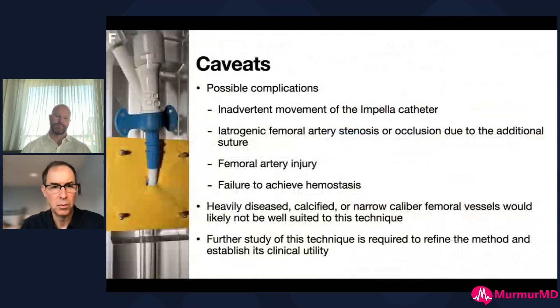Obviously there are possible complications with anything we do. Probably the biggest risk is inadvertent movement of the Impella - you don't want to pull it across the aortic valve in a patient who really needs the support, and you want to avoid pushing it too far in, potentially causing ventricular arrhythmias or even ventricular injury. There's also the potential risk of iatrogenic femoral artery stenosis or occlusion from closing down that arteriotomy. If there's any concern, once you put the repositioning sheath in you can take an angiogram through the wire port to confirm distal flow. Dealing with an ischemic leg would always be a challenge and would need to be addressed promptly.